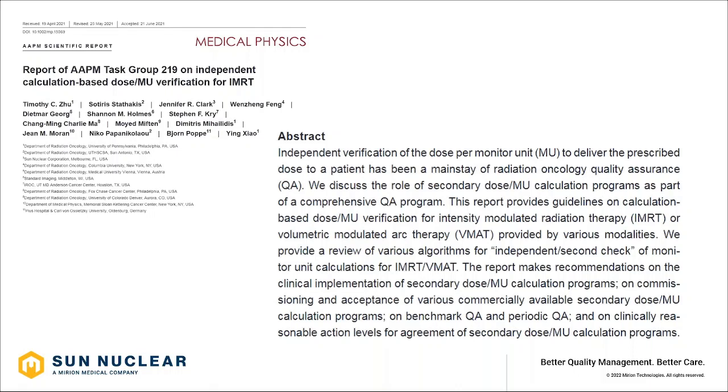The report is intended to be applied as well to verification of MU for other IMRT-based deliveries, such as static gantry IMRT, VMAT, CyberKnife, as well as tomotherapy.